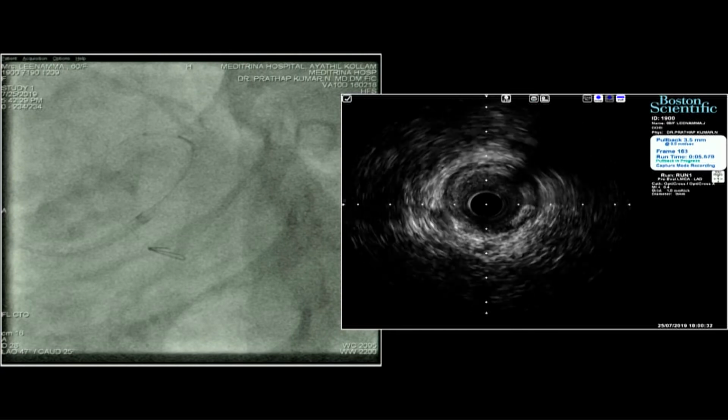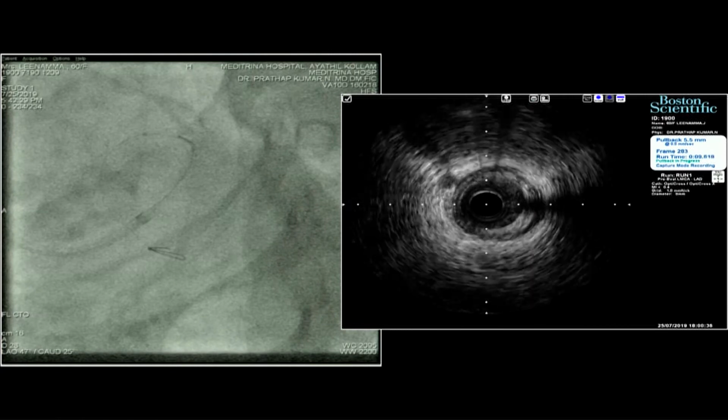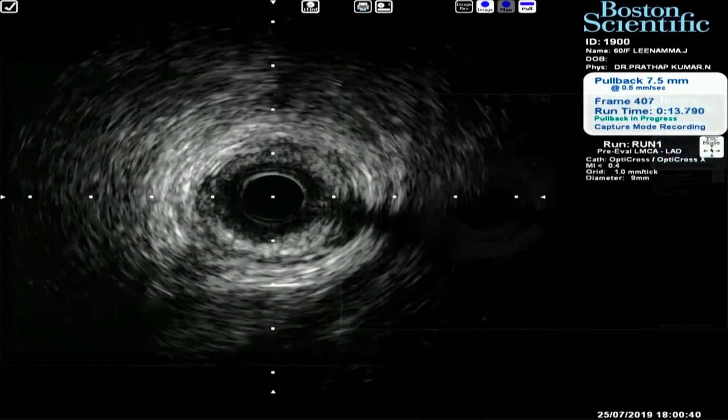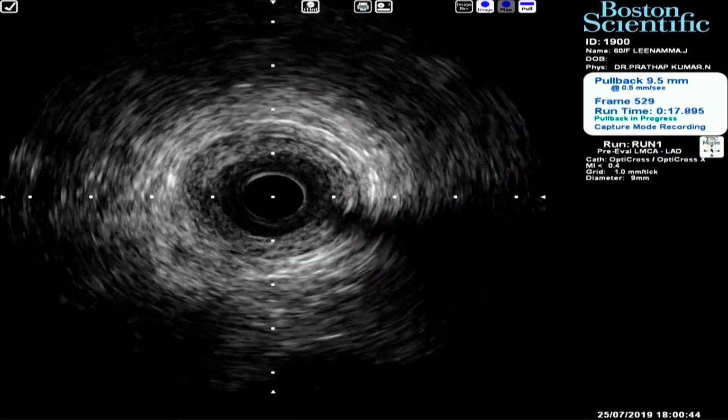Okay. Severe plaque, actually a large plaque. You can see the plaque. In the lumen, minimum 3. It looks like 2.75, maximum 2.75, and 3. A 3 millimeter stent.